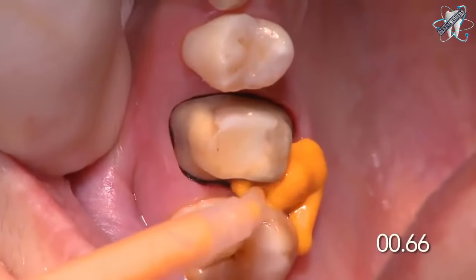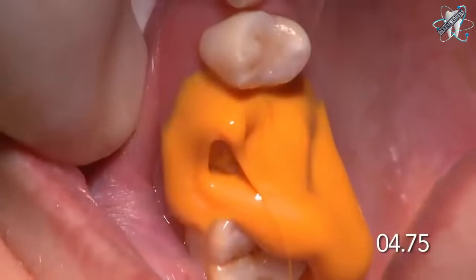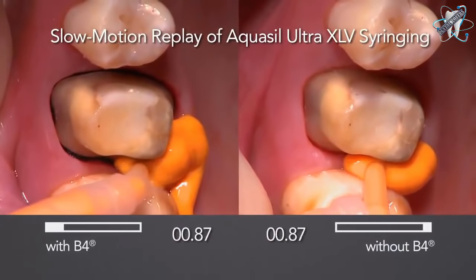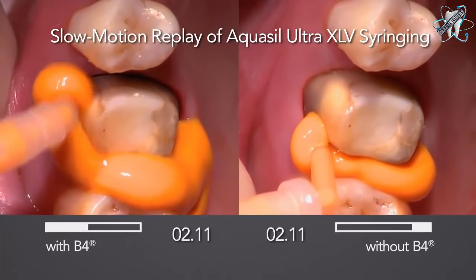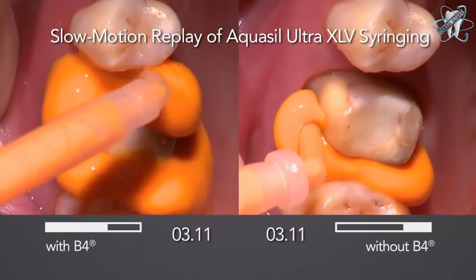AquaSil Ultra XLV wash material is subgingivally syringed onto the tooth prep. B4 Surface Optimizer enhances XLV to flow ahead of the syringe tip subgingivally. B4 allows you to work faster to minimize pulls and drags. Notice the enhanced flow.